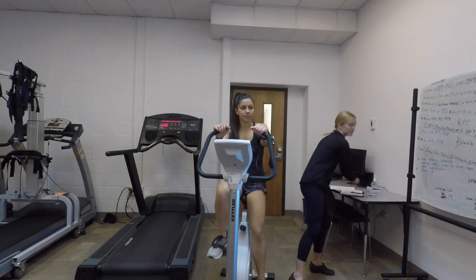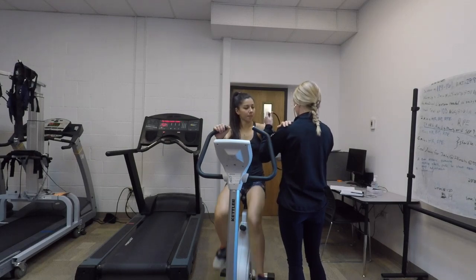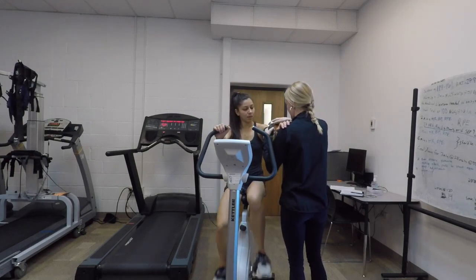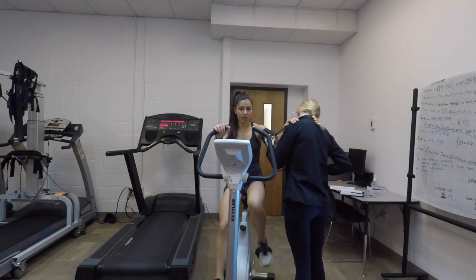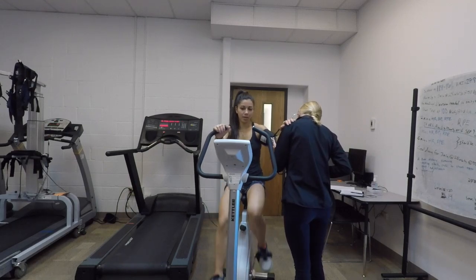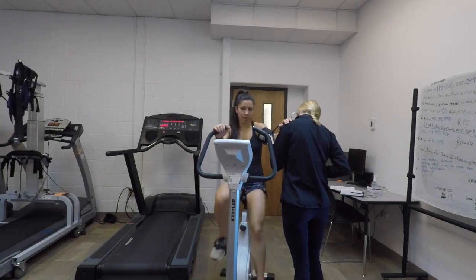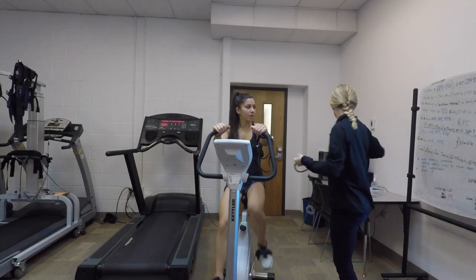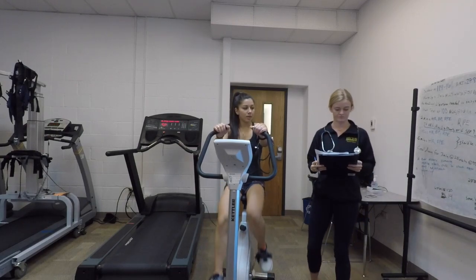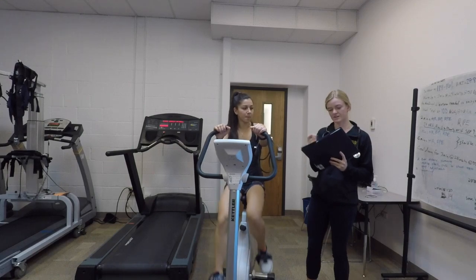And now I will take your blood pressure. You can go ahead and rest your hand on my shoulder. I'm going to stabilize your elbow. And we're going to take your blood pressure. Good. So your blood pressure at warm-up is 116/70.